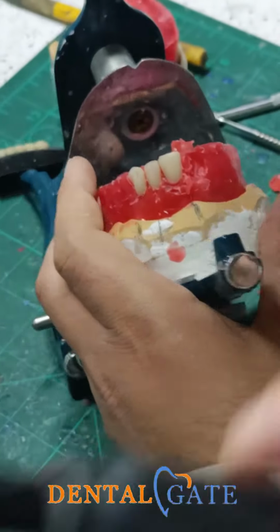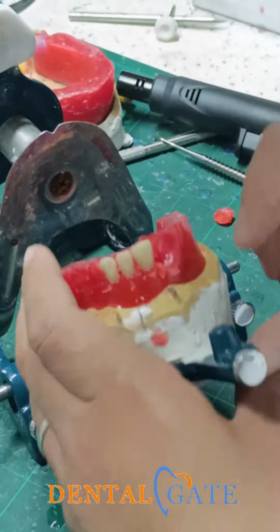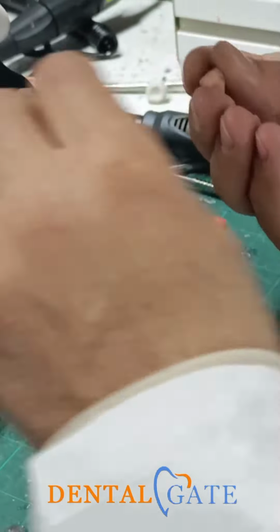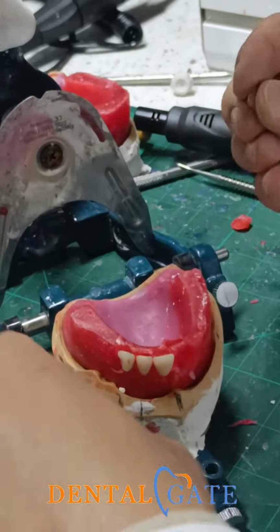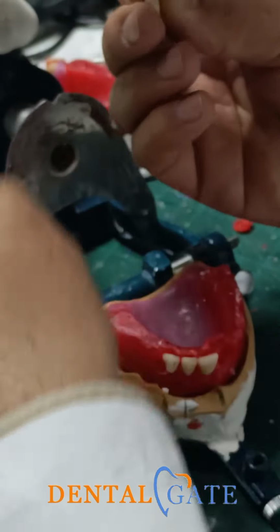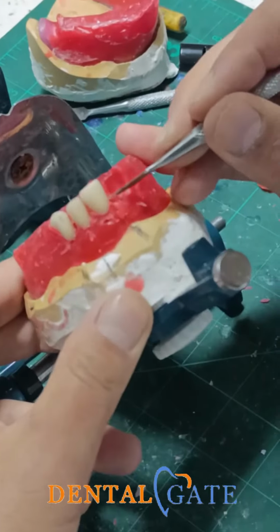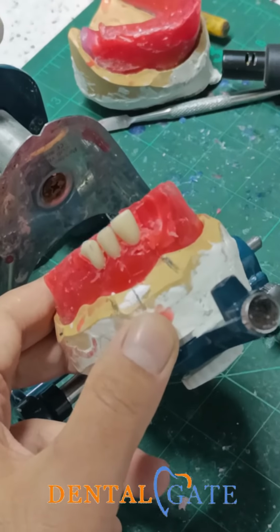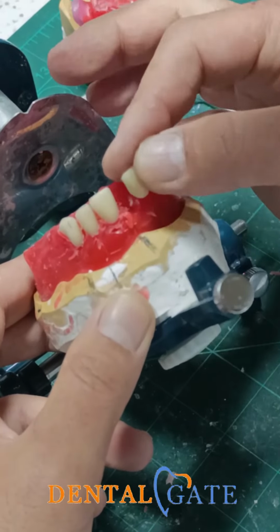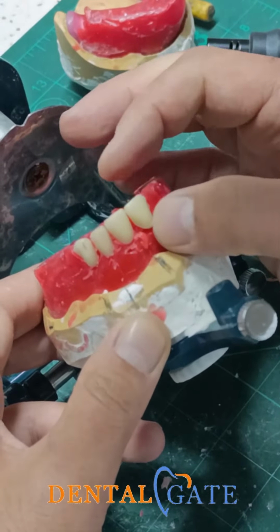Now just make a mounting to the socket of the central incisor and start to put the central incisor in the correct position with the same criteria. Just pay attention to the midline. Please remove any wax in this area. This wax will compromise your sight. So I need to make sure the contact area is put in the proper position.